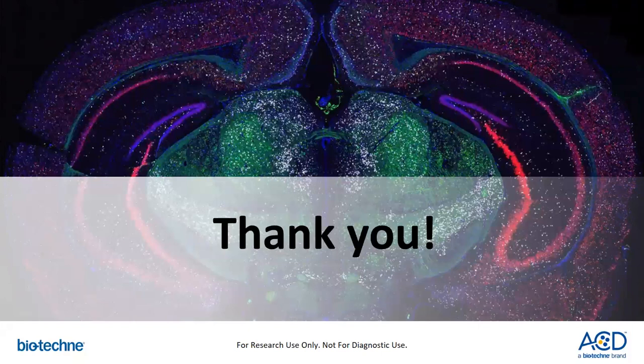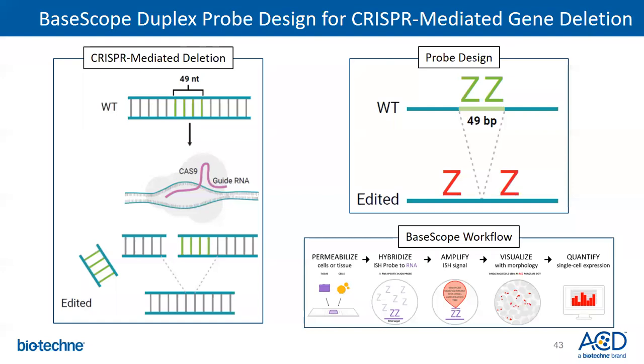For small, like less than 100? Yeah, the question is, what about small RNAs? So that's a BaseScope assay. I don't have a really awesome picture of it. I told you RNAscope probes need 6 pairs to bind somewhere along the transcript before we see 1 dot. BaseScope is different. BaseScope probes are either 1 double Z pair or 1 to 3 double Z pairs. So those of you paying attention, I told you we need 6 to bind before you see a dot. With BaseScope, you have fewer double Zs, but then we just build a humongous tree on top of them. So you have additional amplification steps such that you can visualize even just 1 double Z probe.